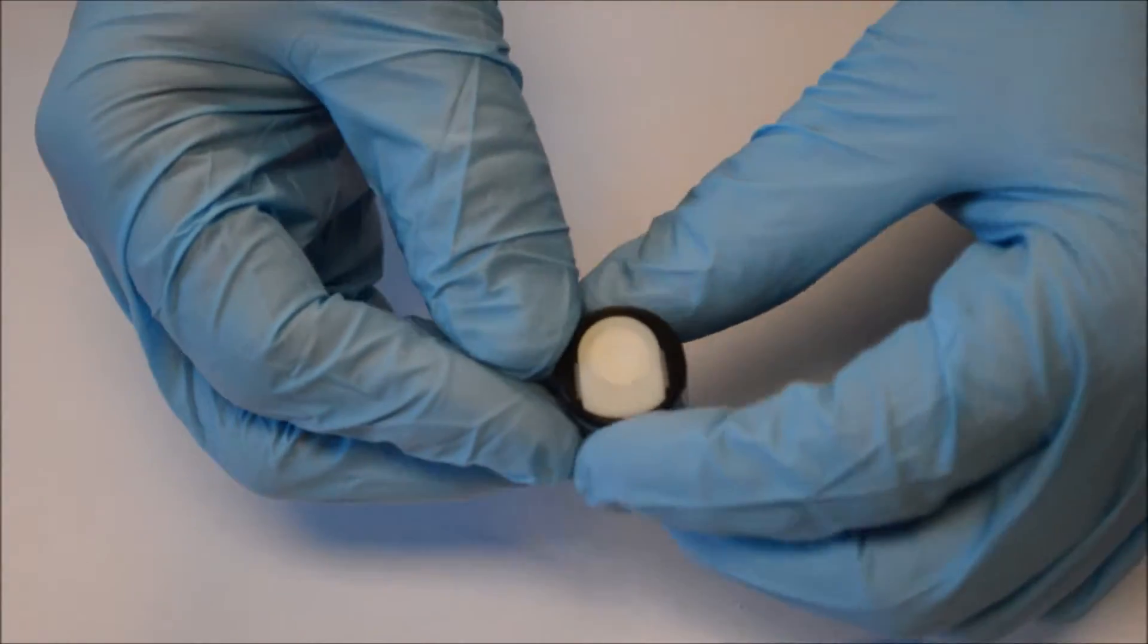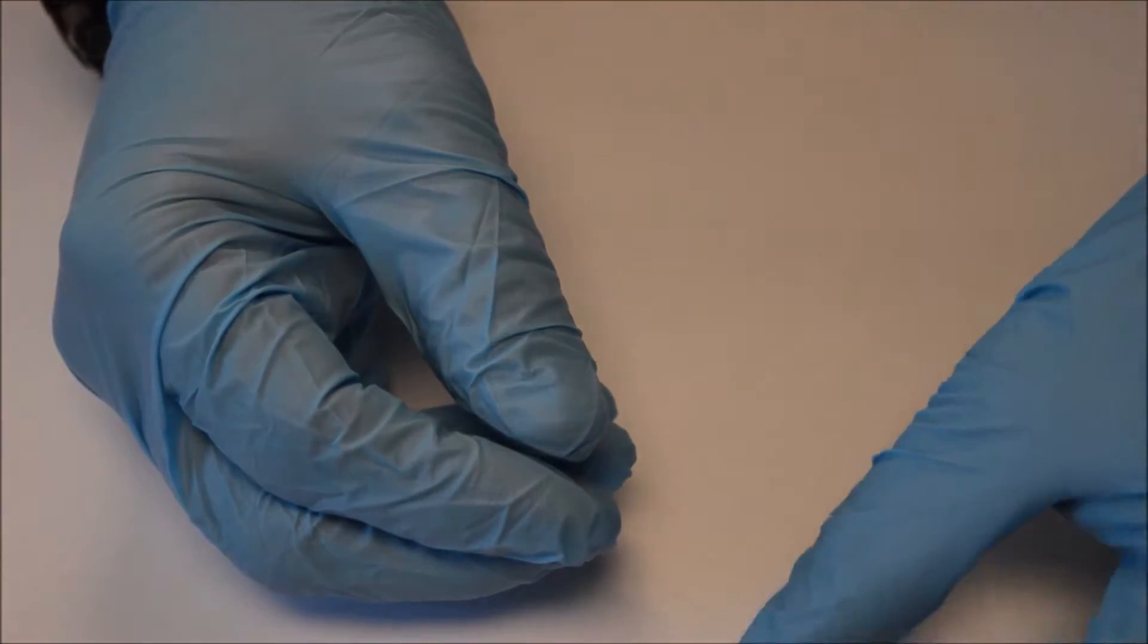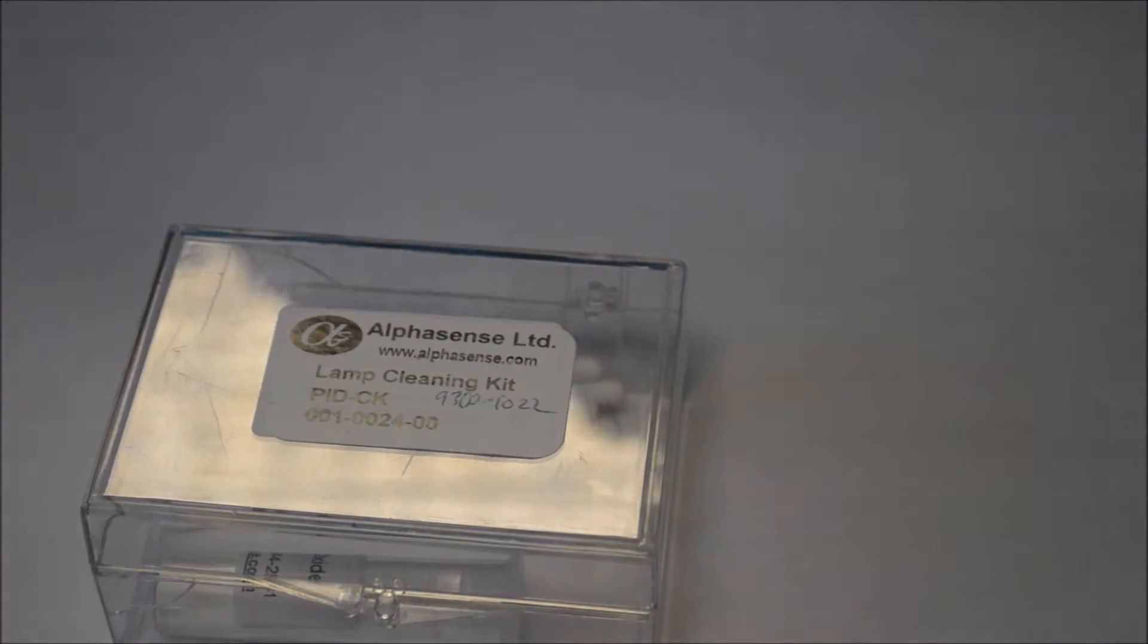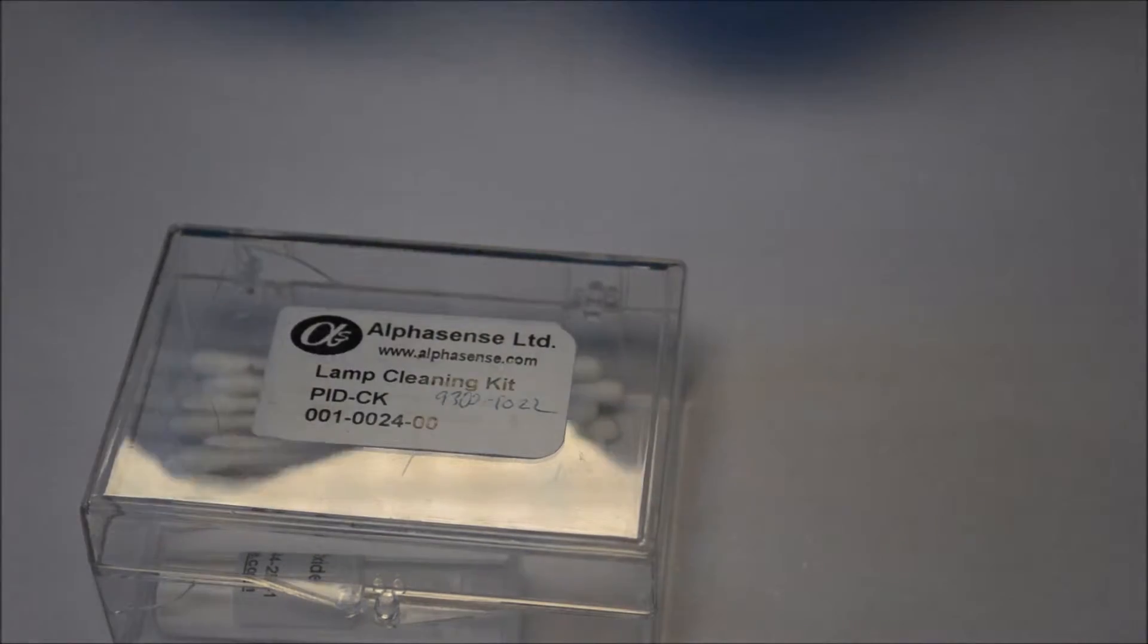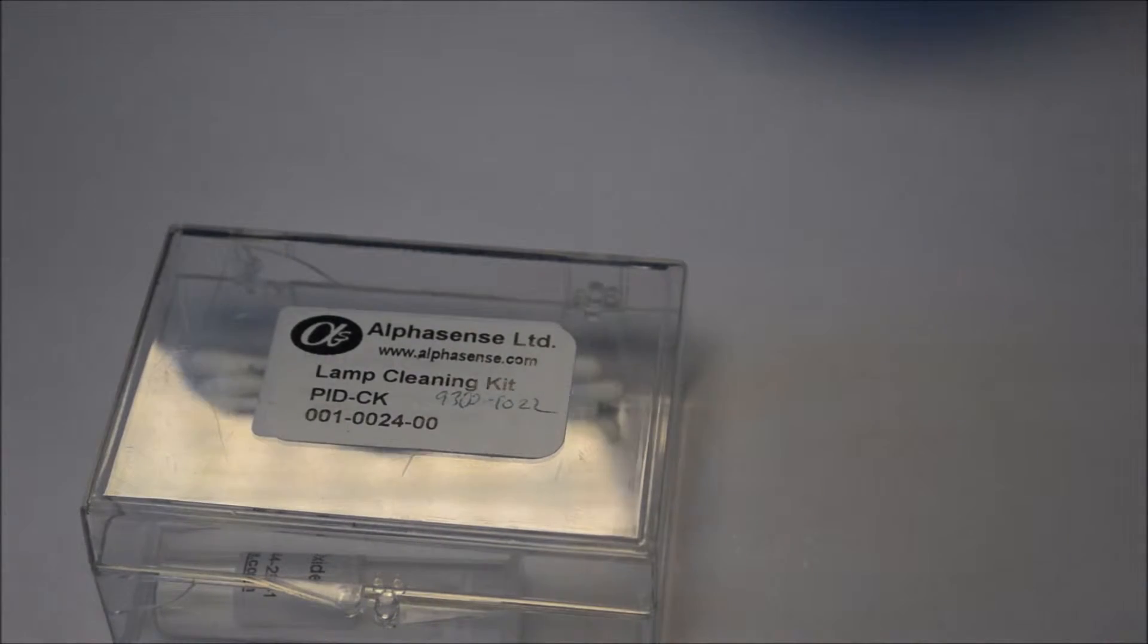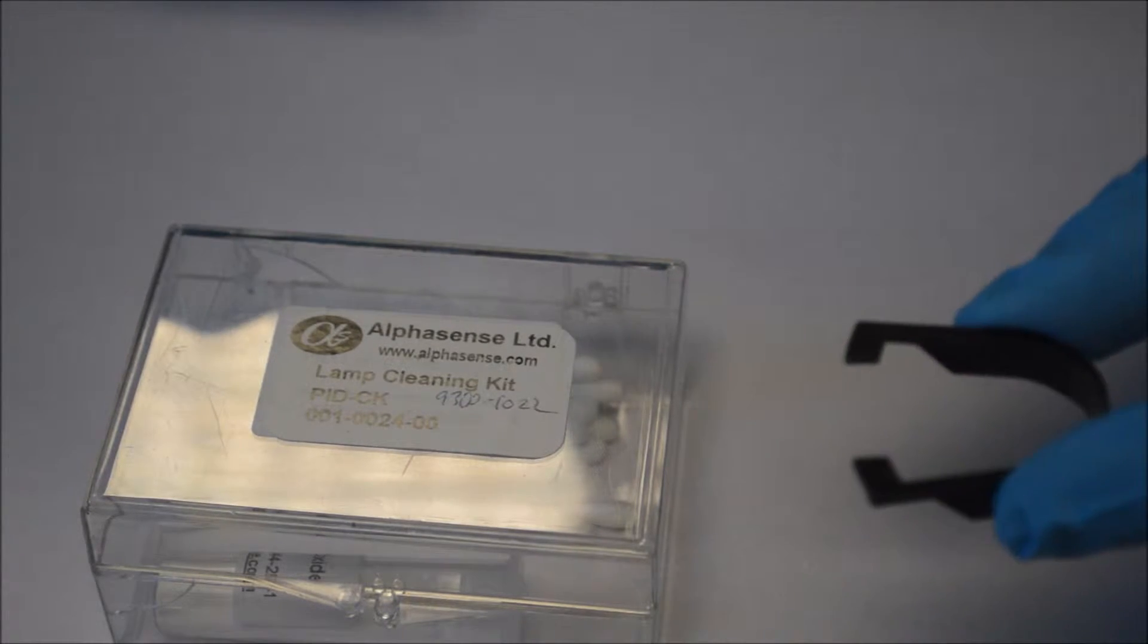The lamp needs cleaning generally every three months, depending on use. The tools you'll need to allow you to do this is you'll need a lamp cleaning kit which consists of some aluminium oxide, a cleaning compound and some cotton buds which allow you to clean the lens and you'll need an electrode stack removal tool.